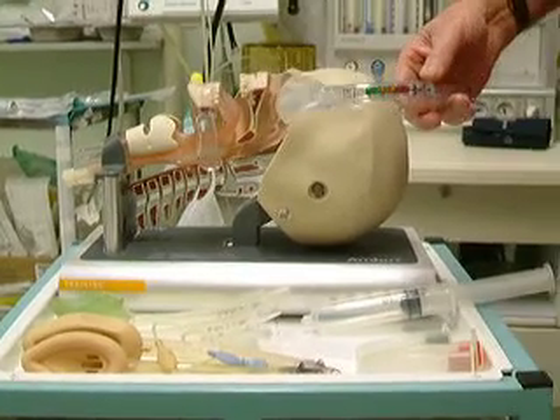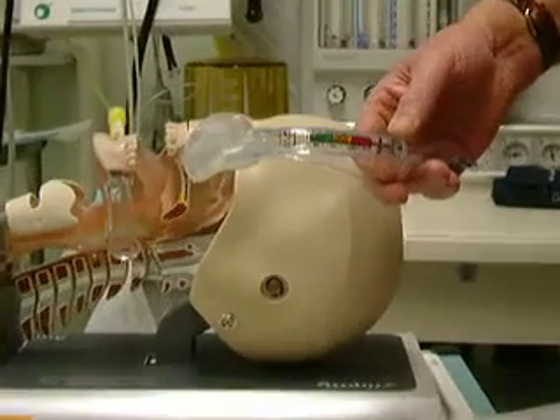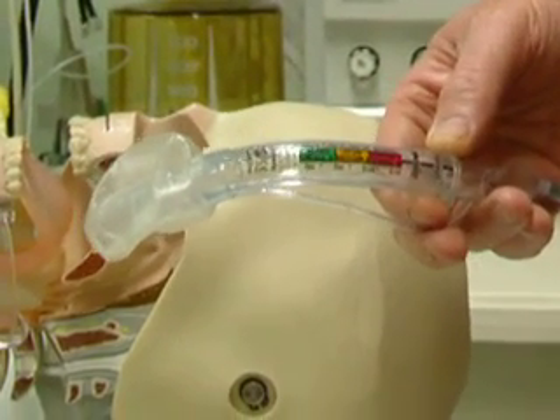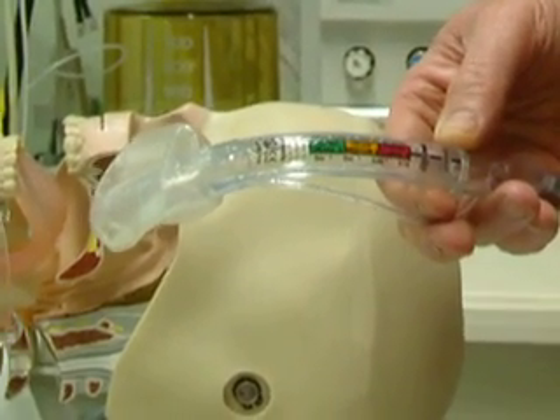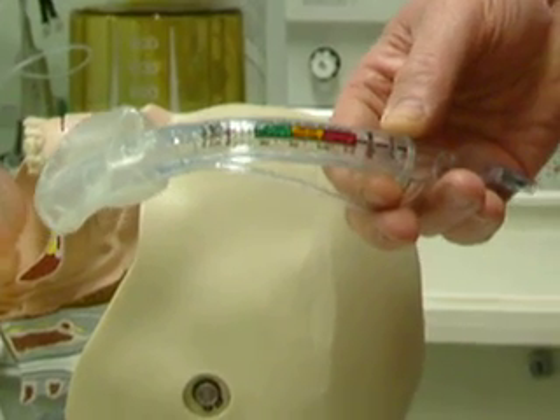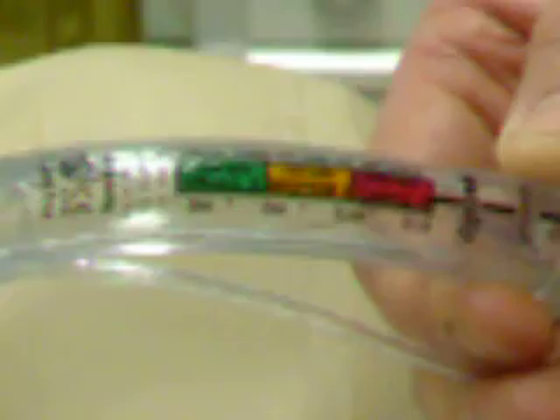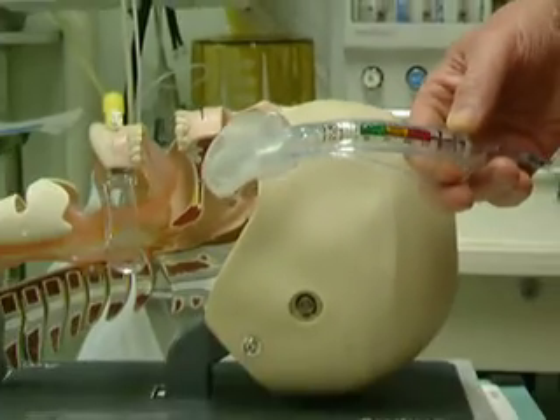We are going to demonstrate the use of a tulip airway in the mannequin. The tulip airway is a small, single-use, disposable, one-size-fits-all, cheap oropharyngeal airway.